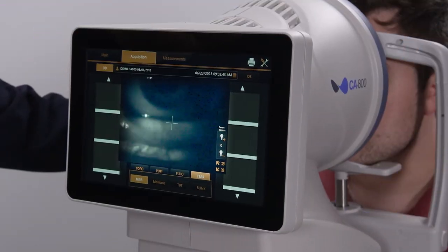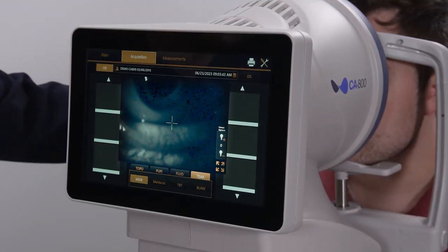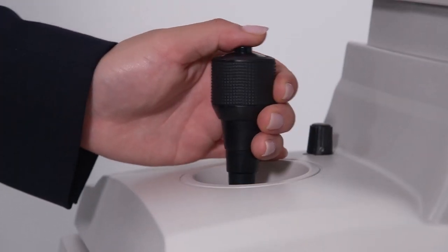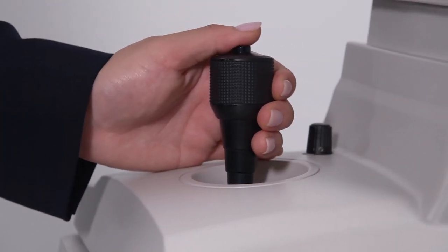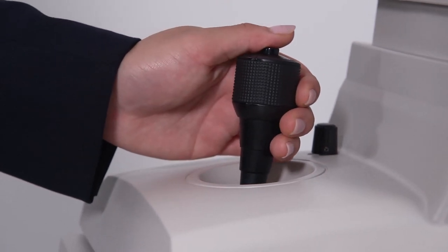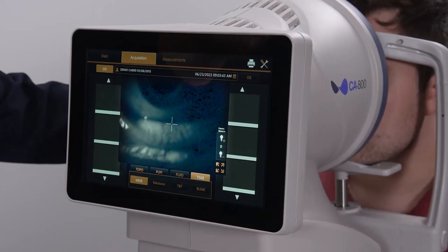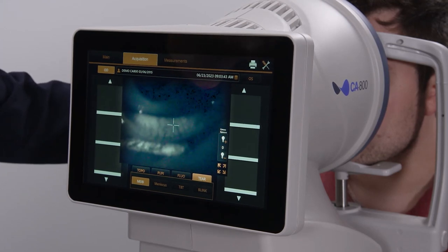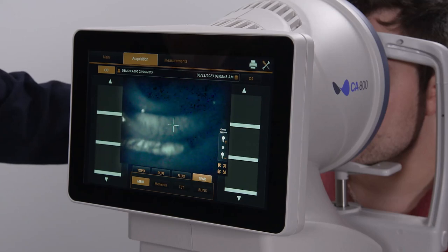Avert the lid and gently hold it in position. In this case, we're looking at the lower eyelid. Use the joystick to position the CA800 so that the inner surface of the eyelid, the palpebral conjunctiva, is in focus. It is not always easy depending on the patient's eyelids, but try to avert the lid in such a way as to create as flat a surface as possible, in order to maximize the area of glands that you assess.